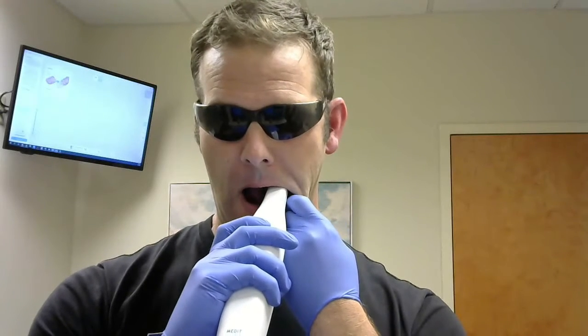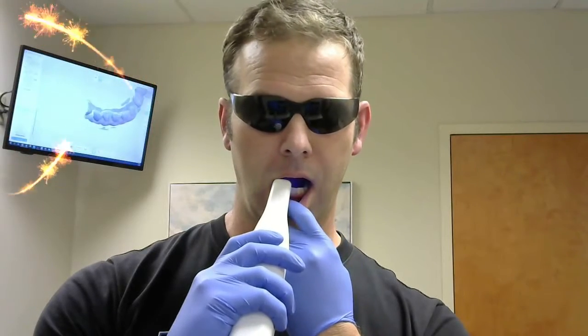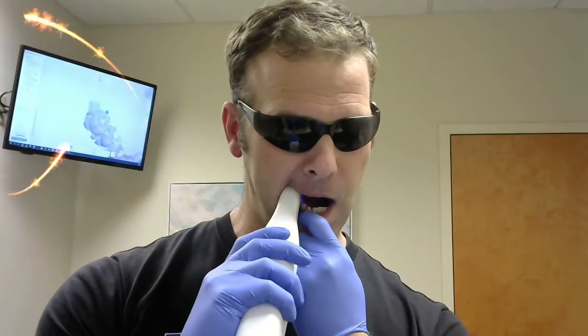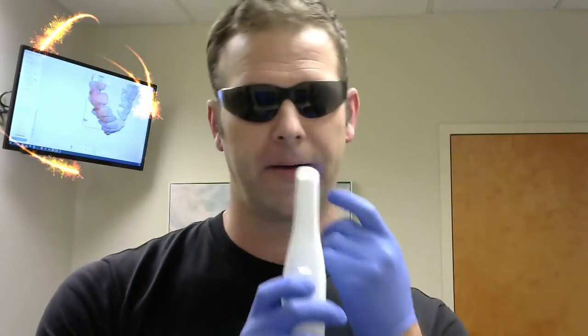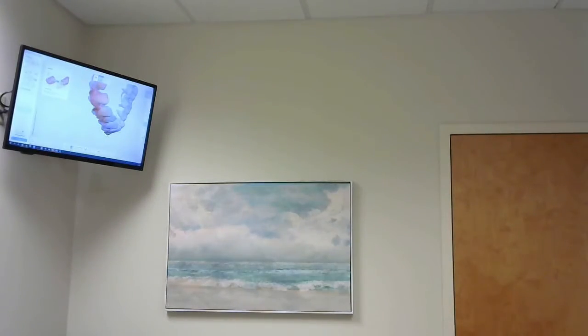We're going to scan my mouth — I apologize because I have some feelings. Please don't be upset. If I'm lucky this will play James Taylor. And that's how it works. If you look behind me there's actually a rendering of my lower mouth. So that's pretty cool.